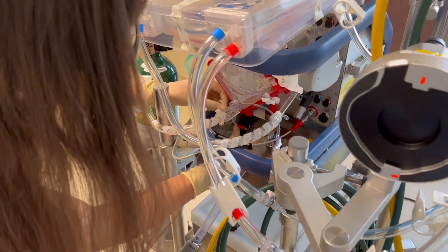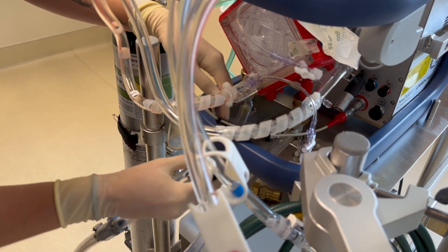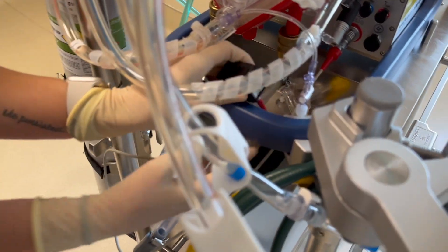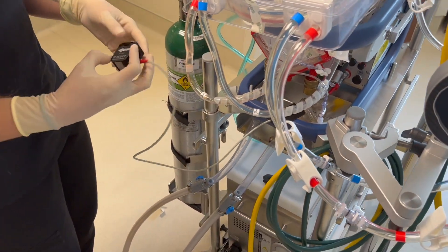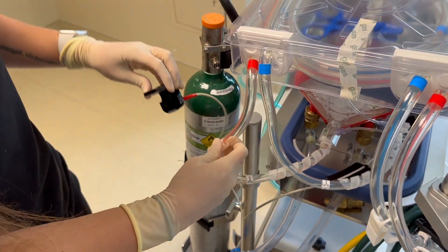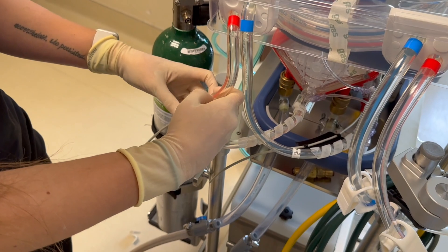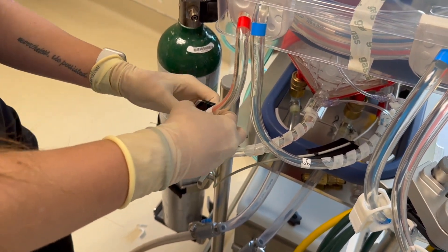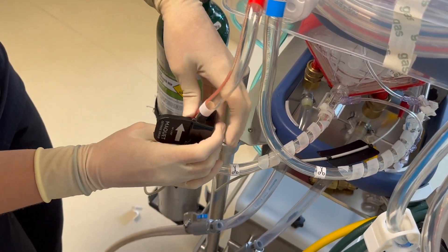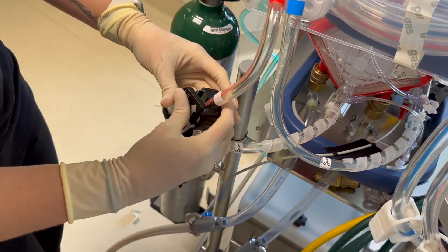Then you will take your flow probe and place it on the return line with the arrows facing your patient. Push the button, open it, and face it towards your patient. Always use your fingers when putting on the flow probe — never the door of the flow probe, or you could break it. It's difficult when there's nothing in the tubing, but use your fingers and then close the door.